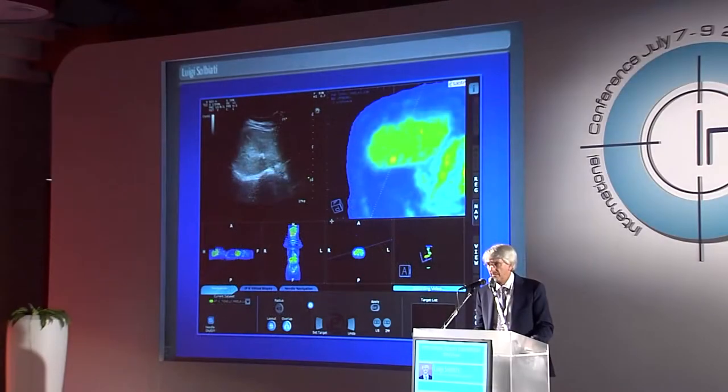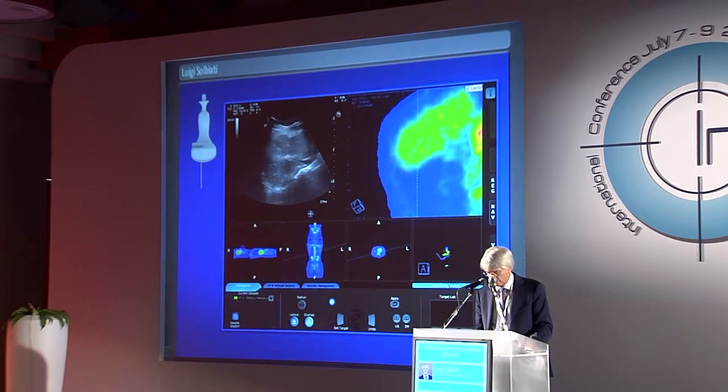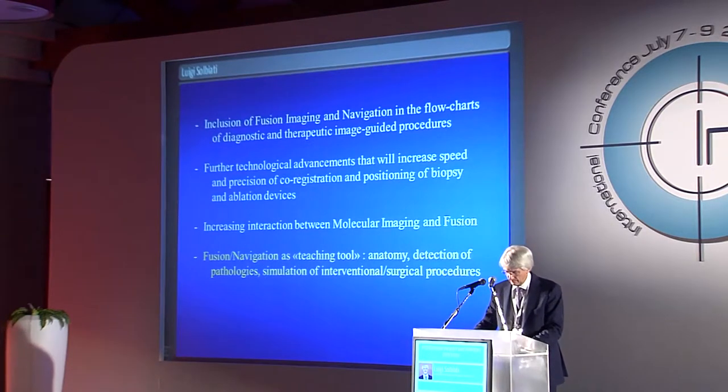This morning, at the end of the presentation, Professor Pitcher mentioned the problem of lymph nodes. In my opinion, this will be one of the most important practical applications of these modalities in the future, because we see lots of lymph nodes in our oncological patients. But what are the real neoplastic lymph nodes? What is the part of a single lymph node in which there is the possibility to take out functioning neoplastic tissue? This is a case of liver, no doubt. Giovanni has already shown a case like this, so I don't want to waste your time. But in this case, the needle is precisely introduced into the target using the modality of fusion.